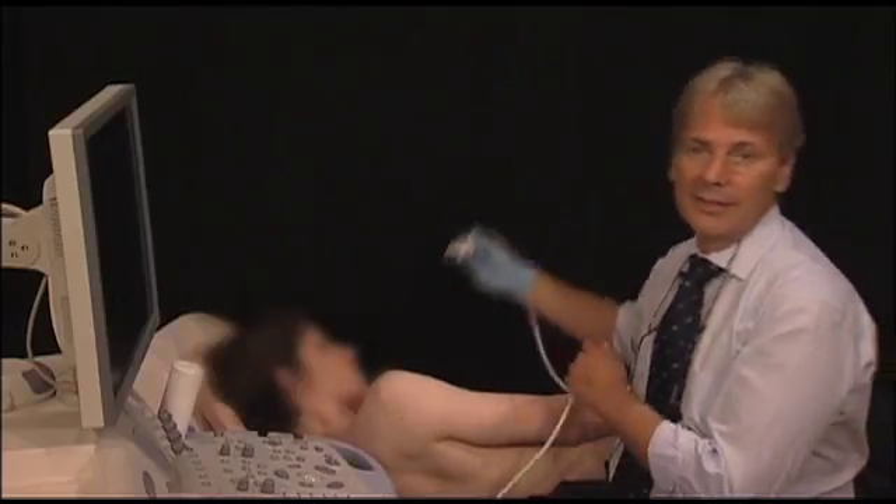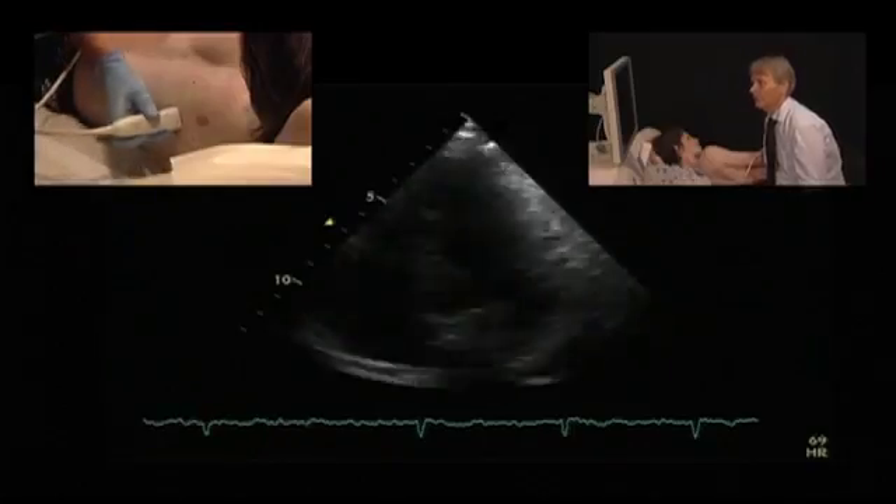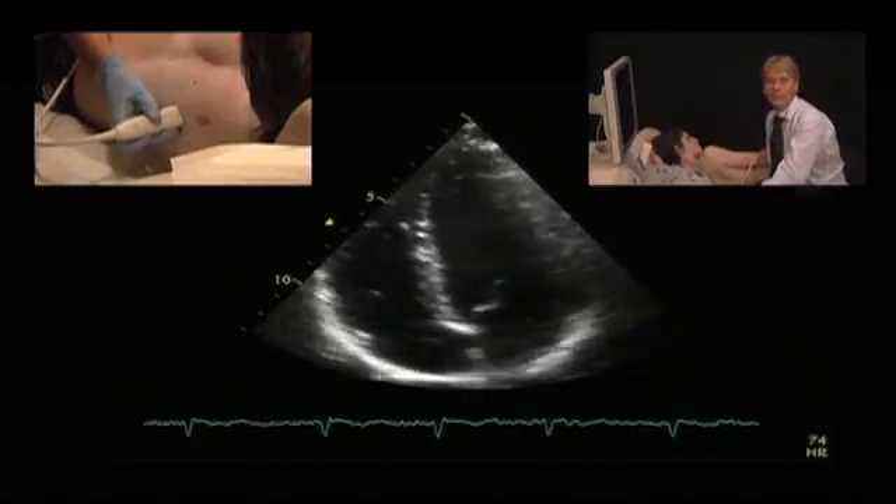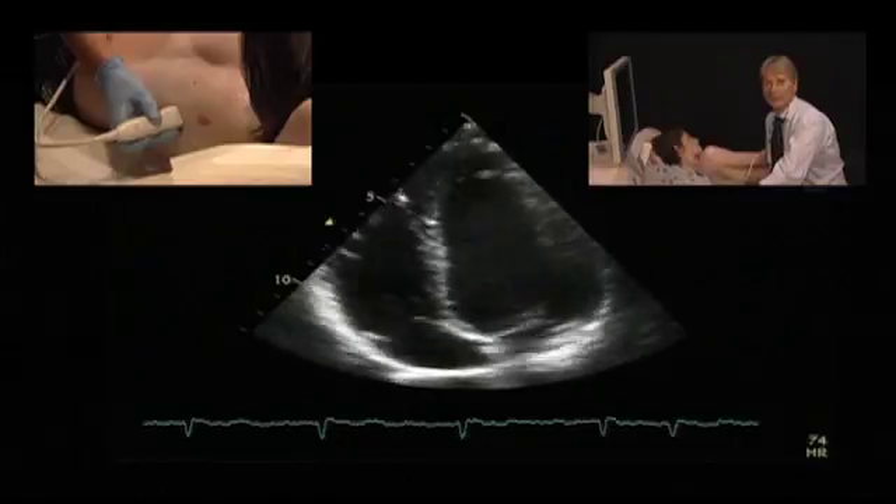In the four chamber view, it's easy to see the right ventricle. However, very often the quality of the images is not as good as you would like them to be, especially for the right ventricle.